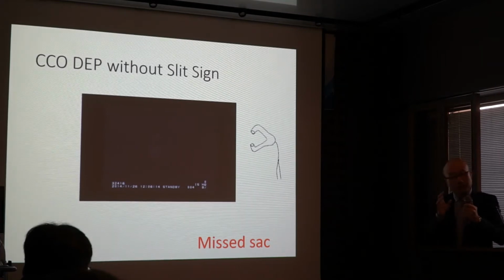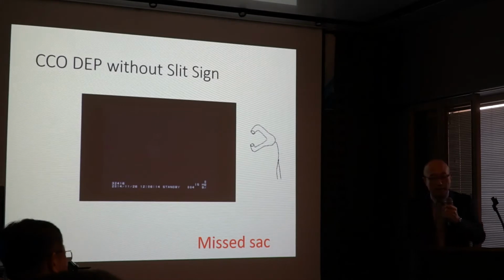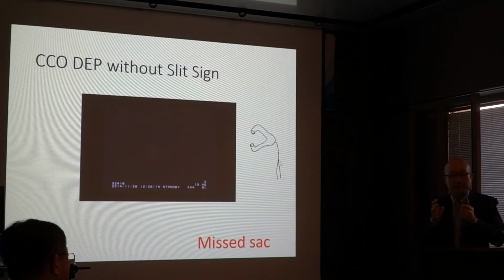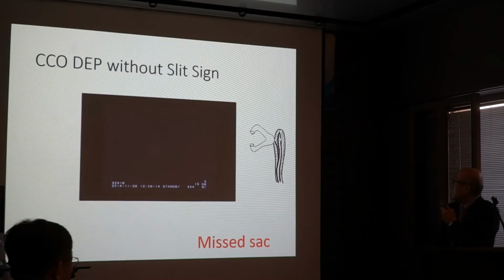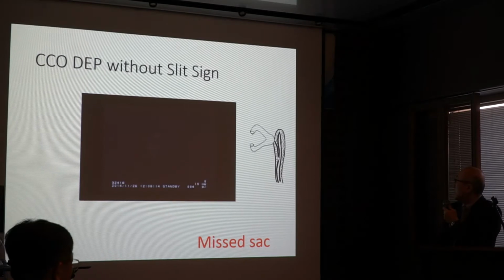Almost all, a majority of that kind of case shows not lacrimal sac fibrosis, but a false passage. And a true lacrimal sac lumen exists just beside the false passage.